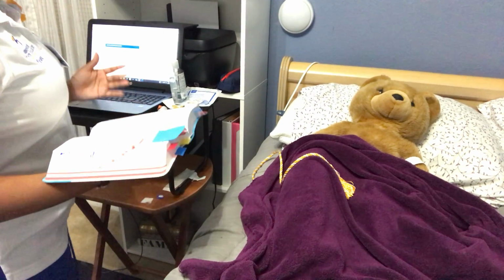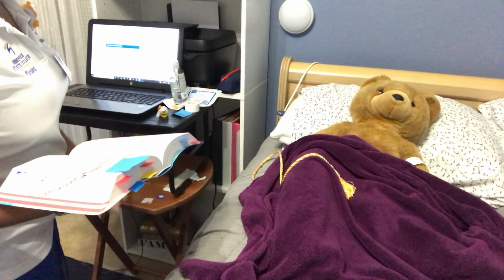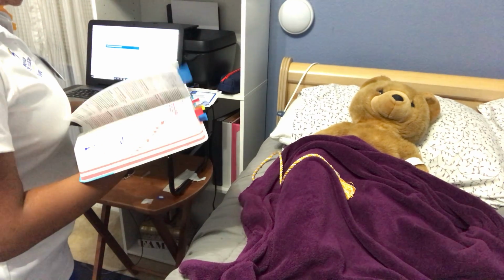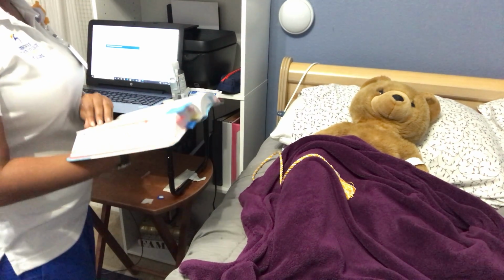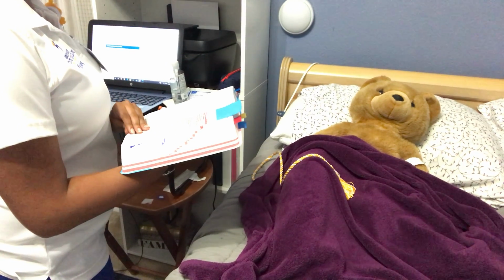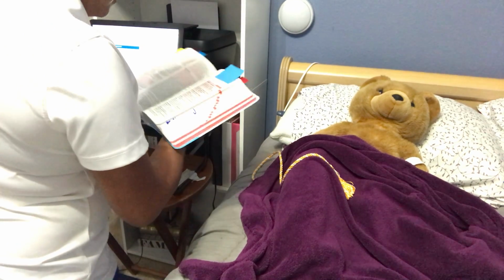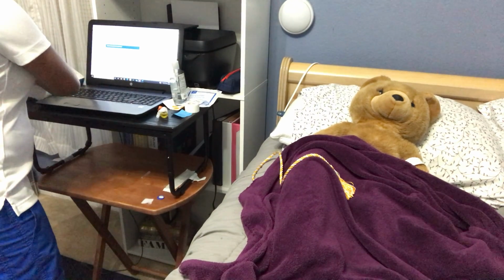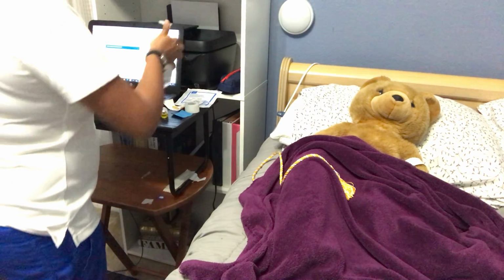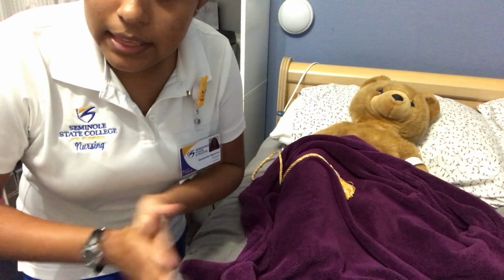The route will be subcutaneously, so in other words, I'm going to do it at the anterior aspect of your thighs. Is that fine with you? Yes. Okay. Have you ever had insulin before? Yes. Okay, and have you had any reactions to it? No. No? Okay. Alright. Okay. Now I'm going to clean my hands again. And I'm going to close the privacy curtain and close the door.